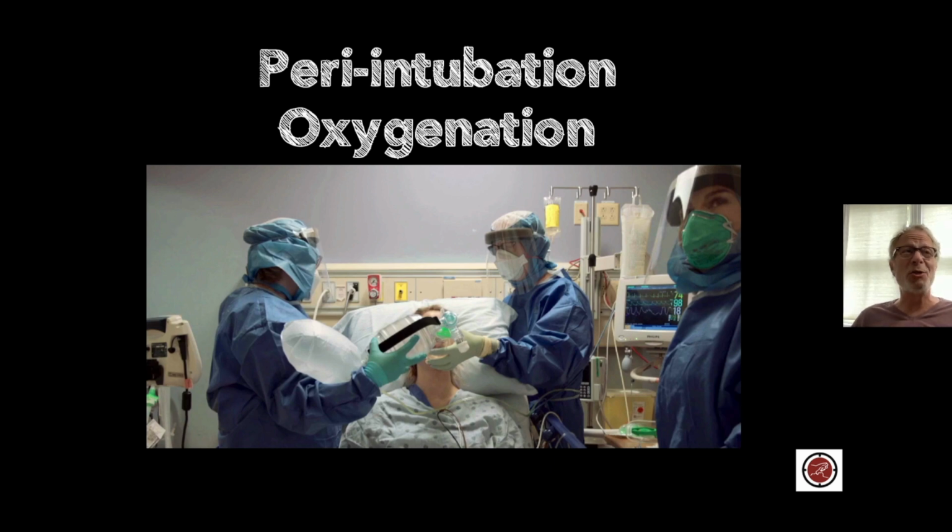These patients in respiratory distress want to sit up. So you're going to do your pre-ox without grabbing their jaw in this situation, by applying the mask to the face. What we're looking at in this scenario is what's going on with the monitor, right? I pay attention to their heart rate, and we check their blood pressure, which is cycling every 1 to 3 minutes at this point.